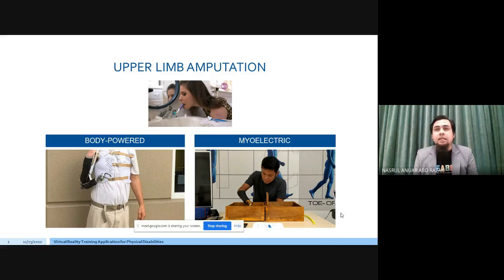But the good thing is that it is really easy to control, because it is known as an open loop and also closed loop system. So you know about direct measure and also indirect measure of how you want to use your upper limb prosthetic to conduct daily life activities. Of course, there will be some restrictions. It will be difficult for you to pour a cup of water, or to eat, for example, but yes, it can help you conduct your daily life activities.